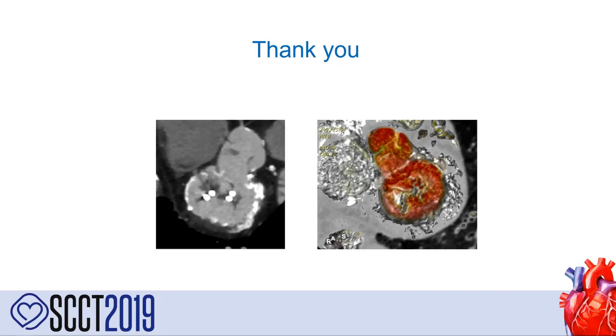Right. Okay. Well, for deciding whether to fracture the valve, it's something we do much more often in the aortic position. In the mitral position, what you would look at is what you expect to be the EOA after the new valve is placed.